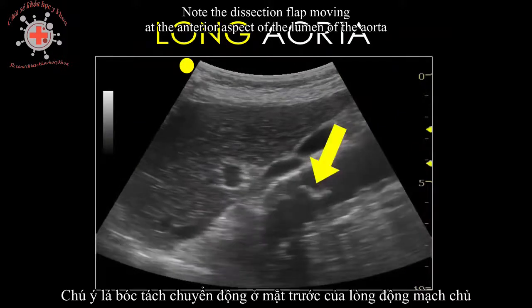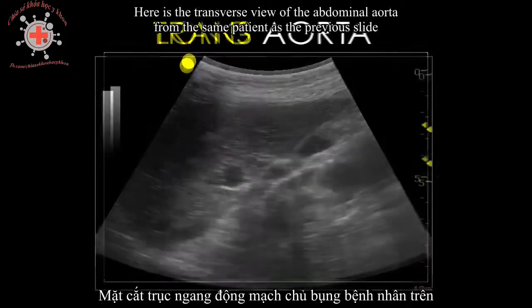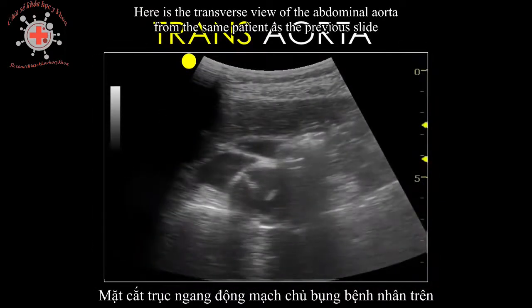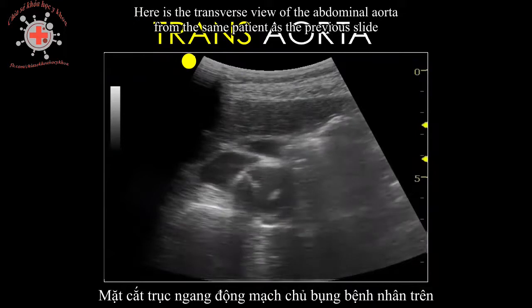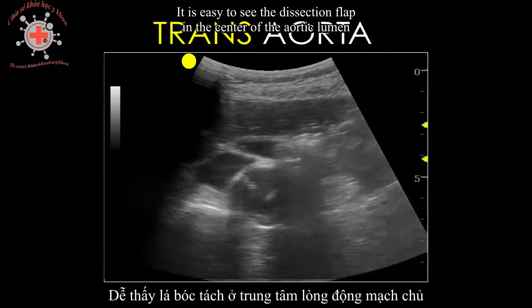This video demonstrates a longitudinal view of a dissection of the abdominal aorta. Note the dissection flap moving at the anterior aspect of the lumen of the aorta. Here is the transverse view of the abdominal aorta from the same patient as the previous slide. It is easy to see the dissection flap in the center of the aortic lumen.